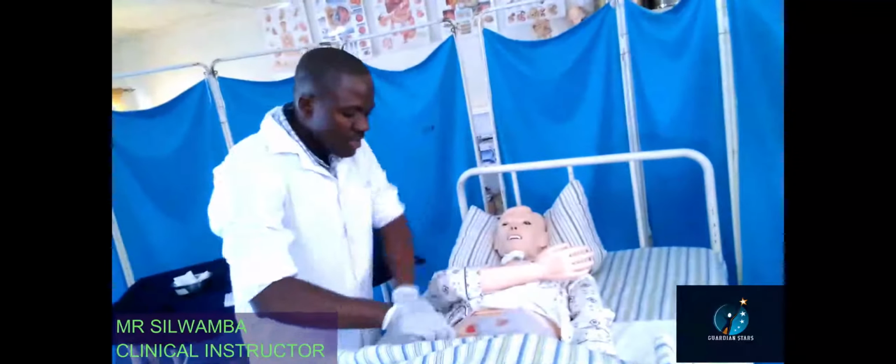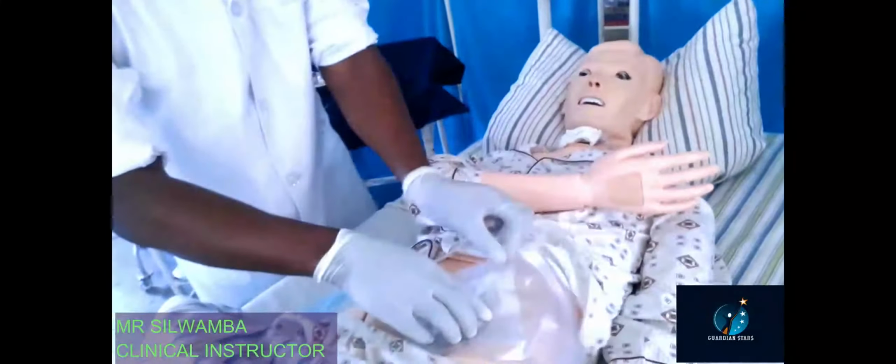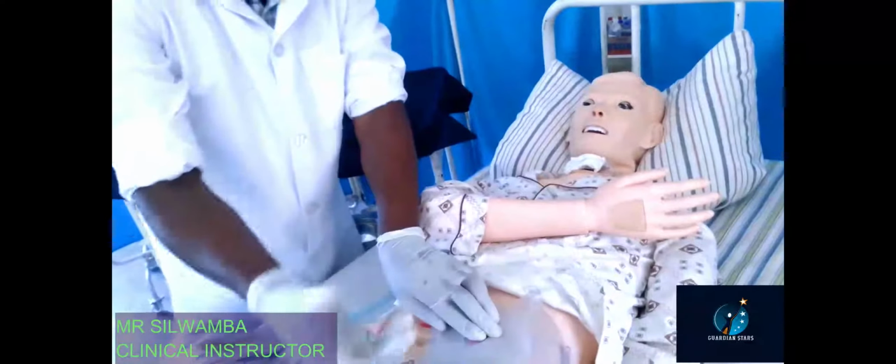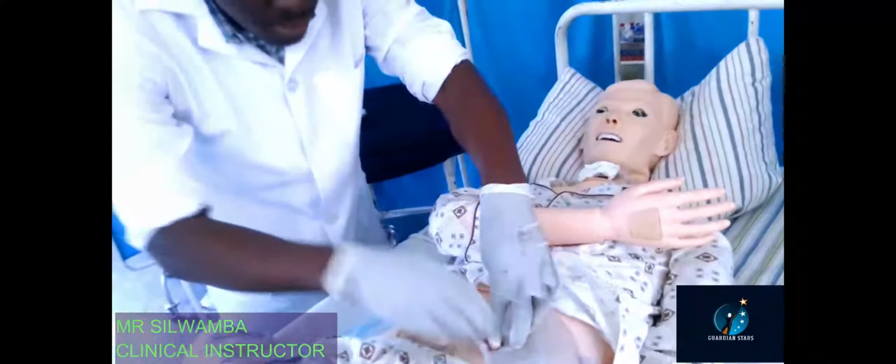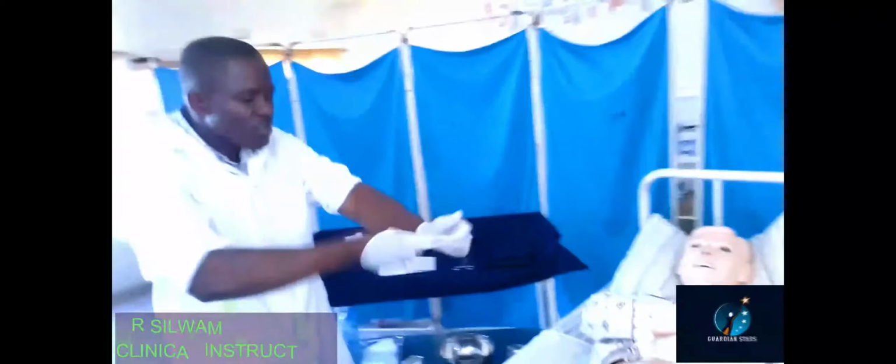Then the next thing, while the gloves are on, I want to loosen it up so that it's easy for me to remove it with the forceps. So it's loosened up all around. Okay, Mr. Mwila, now let me just go and scrub so that I come and do the cleaning. As I said, strategy in OSC: you remove your gloves like that, inside out, and discard them there. So instead of washing hands 3 times, it's only twice: before starting the procedure and when scrubbing.